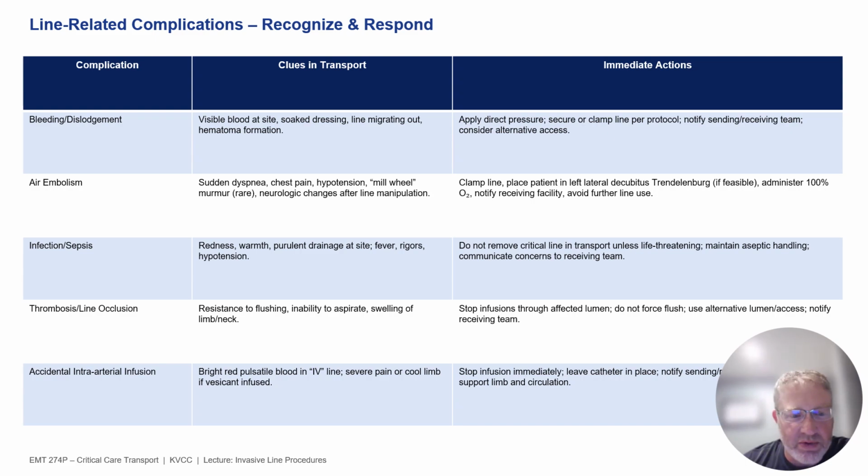Right, down to thrombosis and line occlusion. Thrombosis means stop trying to push through that lumen and use an alternative.